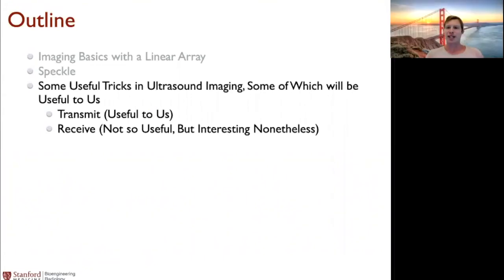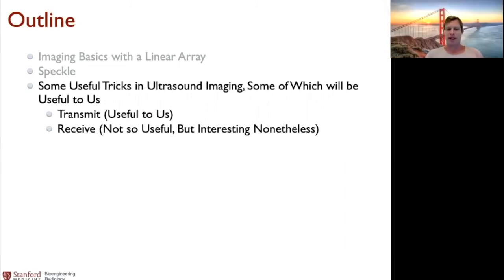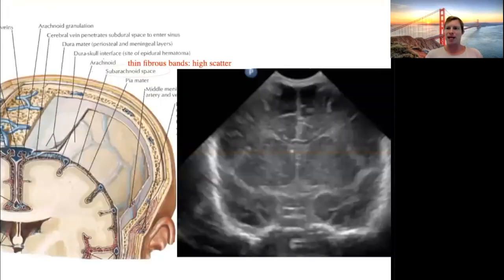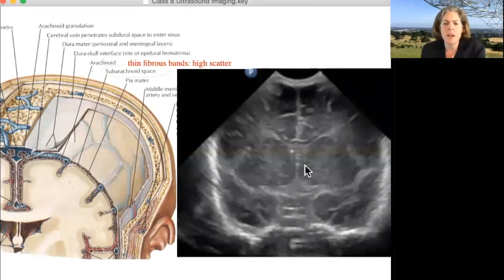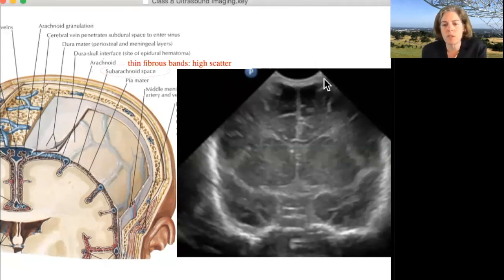Of course, ultrasound imaging isn't something we can do typically in adults or even older children, just because of the skull, because of attenuation, which we talked about at great length already. What would people use it for with the child, to look for gross brain abnormalities, like some sort of small brain or swelling? Yeah. I mean, if there's a tumor, for example, and the structures are off to the side, you can see that kind of thing. No, I'm not a radiologist. I don't know all of the uses for it, but there definitely are uses for ultrasound in newborn imaging.